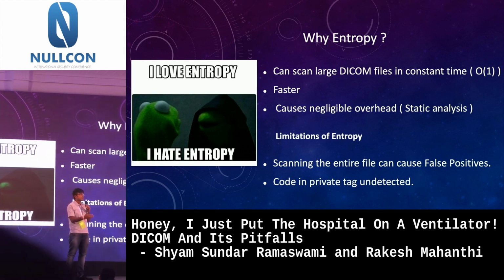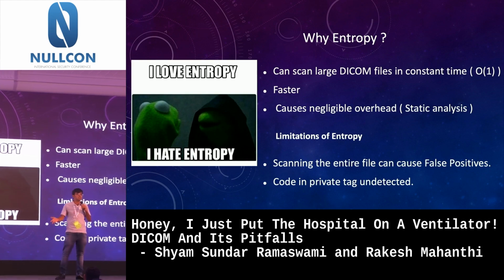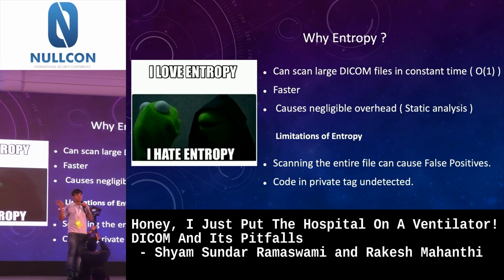So if you choose heavy processes like machine learning inference and other things to figure out whether a DICOM is malicious or not, that's going to hit your performance very badly. So we decided to go with a static analysis technique, using entropy as a metric to figure out malicious stuff in the preamble section of the DICOM file.